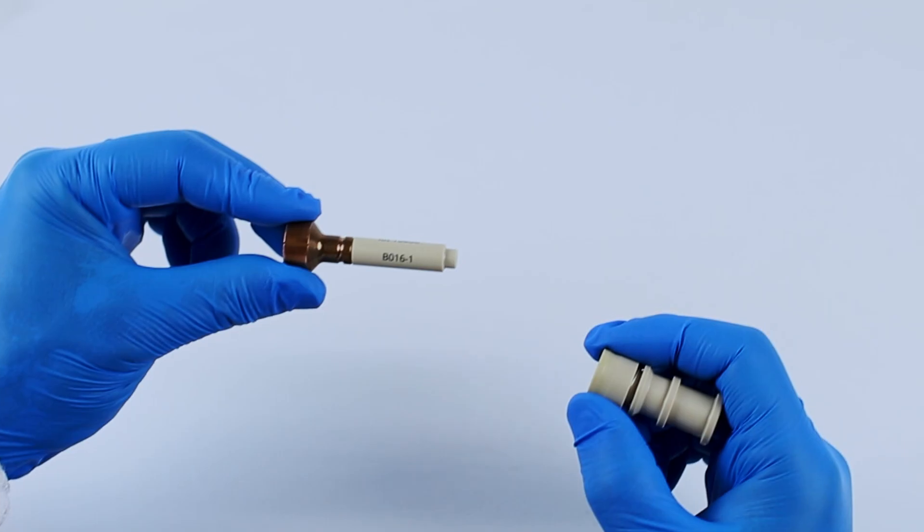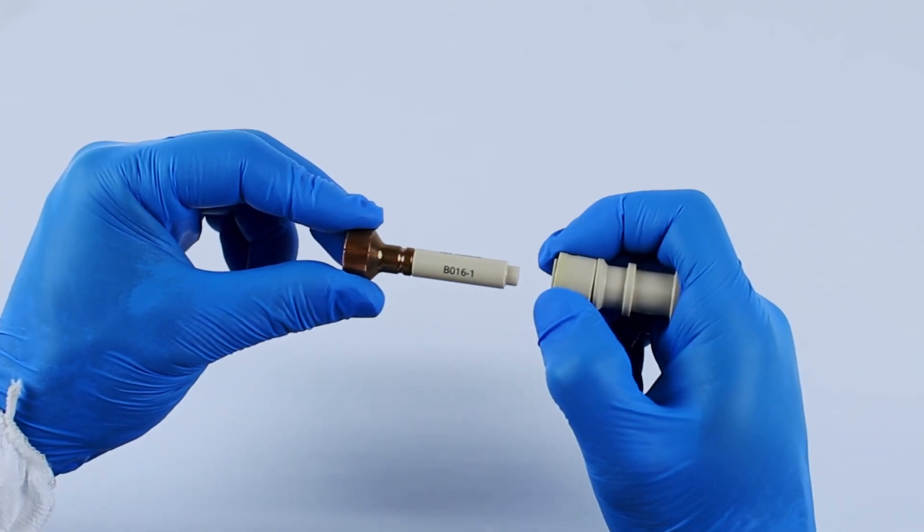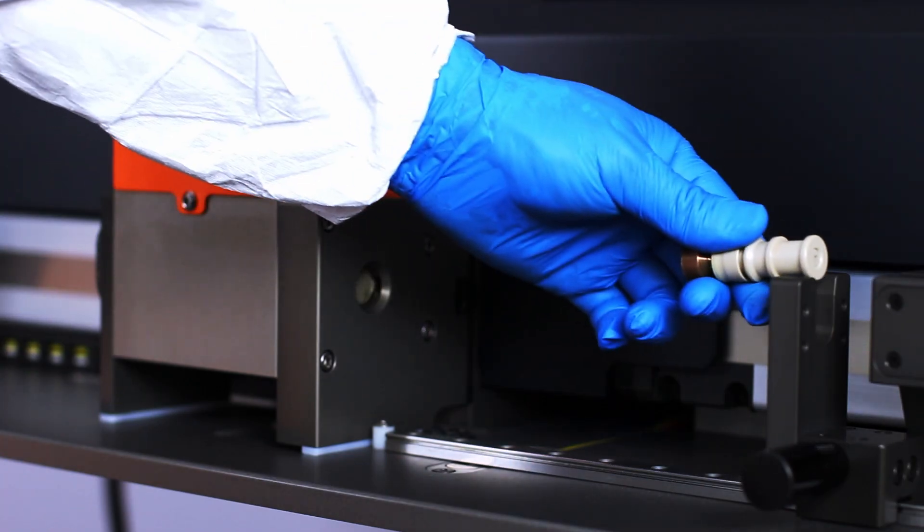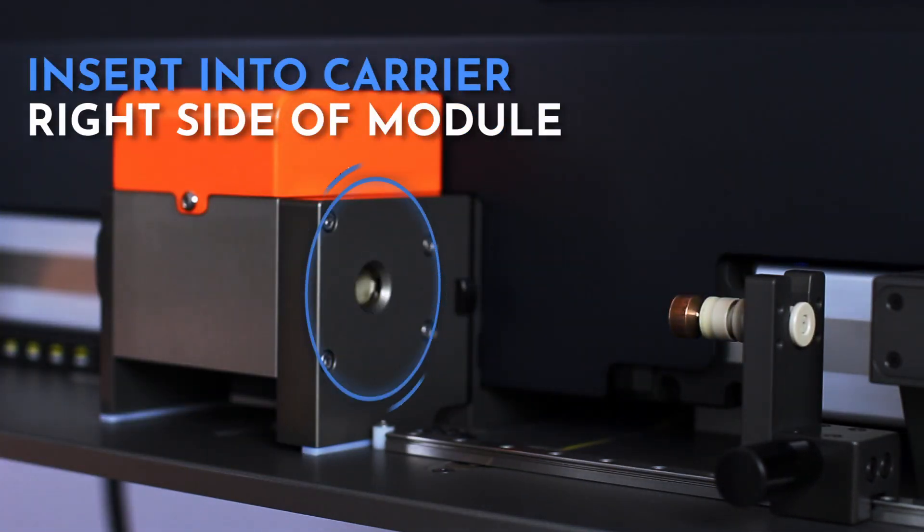To attach the Quick Connect holder to the right end plug, retract the sleeve and insert the end plug into the chuck. This assembly can then be inserted into the carrier on the right side of the module.